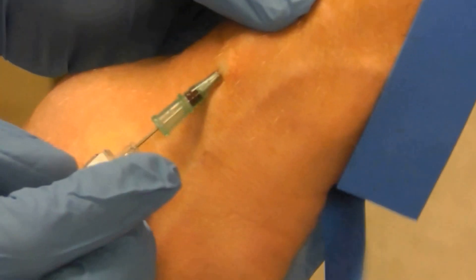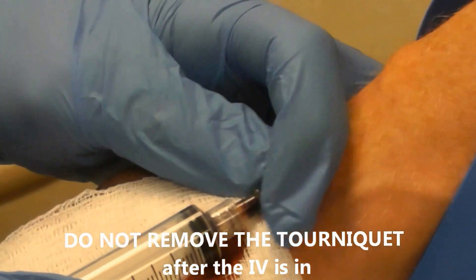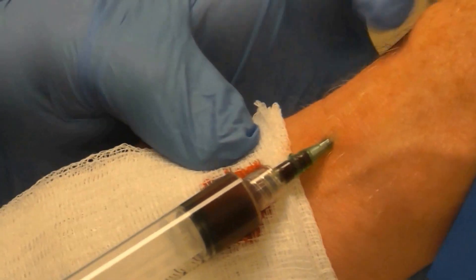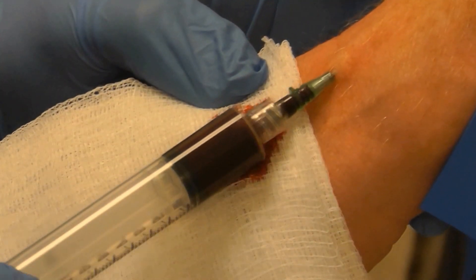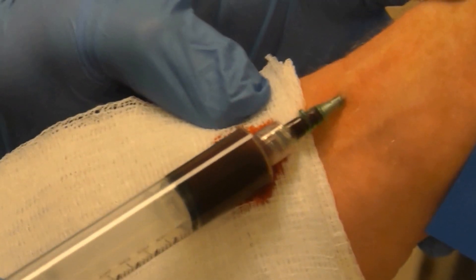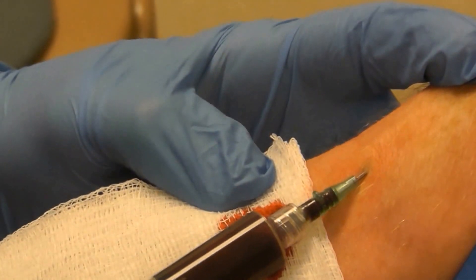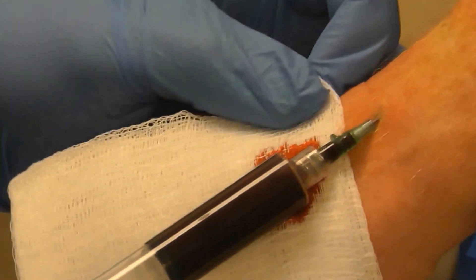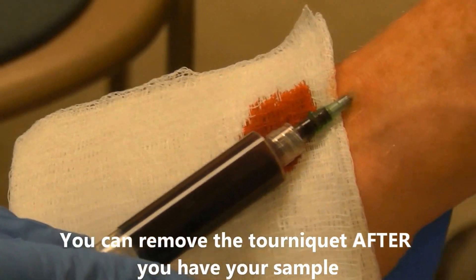Now this is where it's a little bit different. You just attach a syringe and now you just aspirate. If you pull back too fast, it'll actually suction the vein flat. So if you're having problems getting blood back, go ahead and just try to aspirate a little slower. Sometimes you can move the angiocath backwards and forwards, but this is a big enough vein to where I don't need to do that. So when I get the amount of blood that I need, now I can take the tourniquet off.